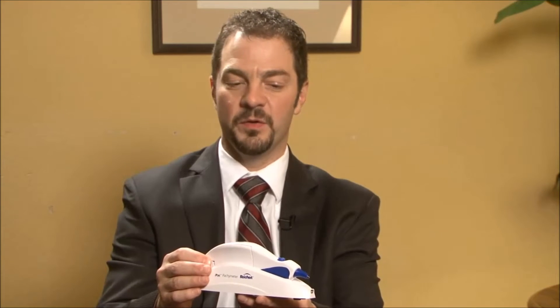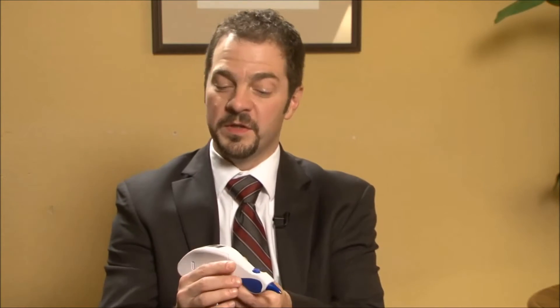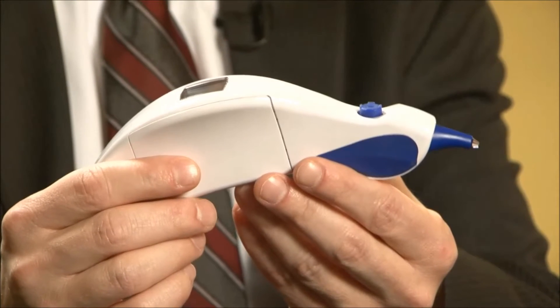The optional charging cradle is a very convenient location to rest the device in between uses, and that ensures that the device is always going to be fully charged and ready for your next measurement. I'll put that aside for now. It's very lightweight, and the design — the form factor of it — is based on our award-winning Tonopena Via product.